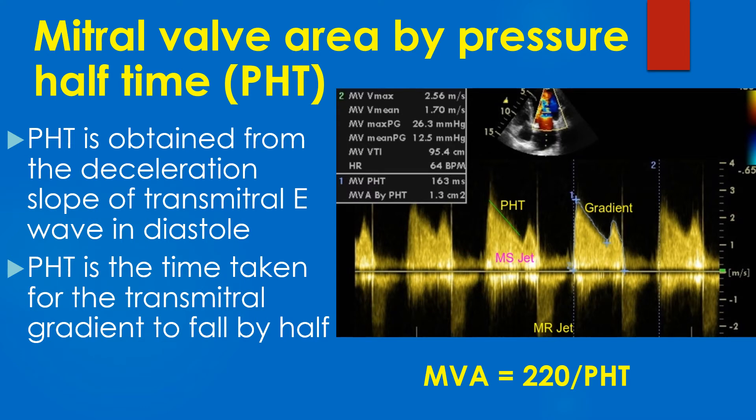PHT is the time taken for the transmitral gradient to fall by half, or the transmitral velocity to fall by root 2. A PHT of 220 milliseconds corresponds to a mitral valve area of 1 square centimeter. Dividing 220 by the measured PHT gives the estimated mitral valve area. In this case the PHT was 163 milliseconds, giving an estimated mitral valve area of 1.3 square centimeters.